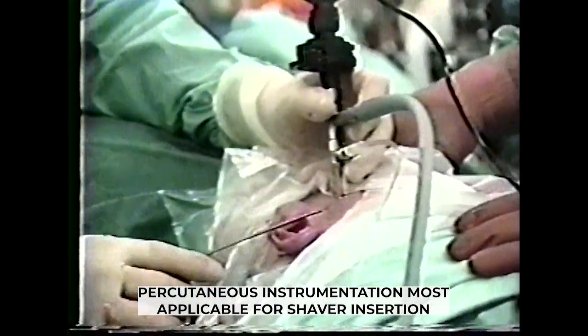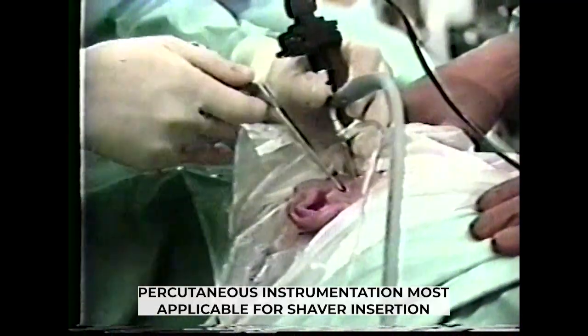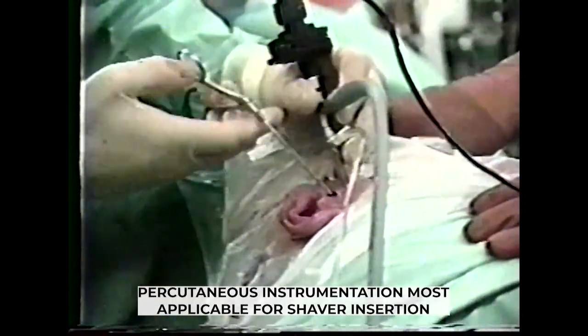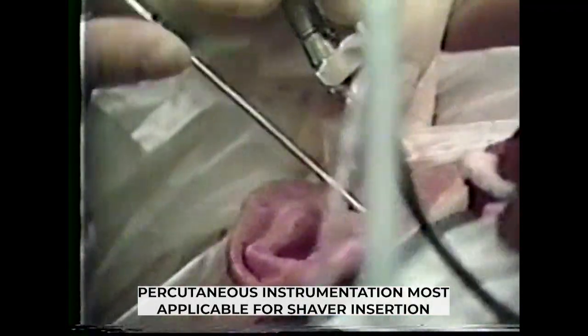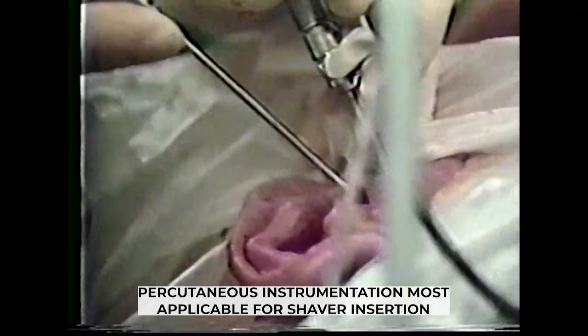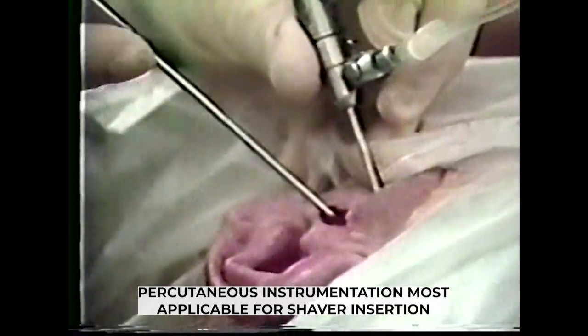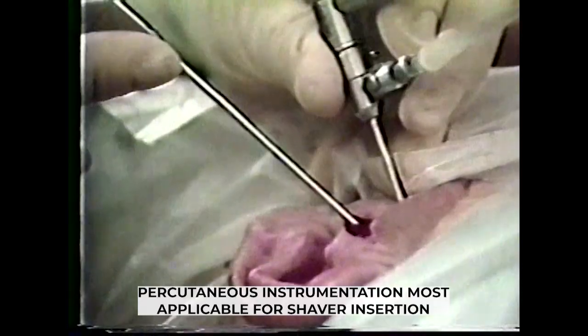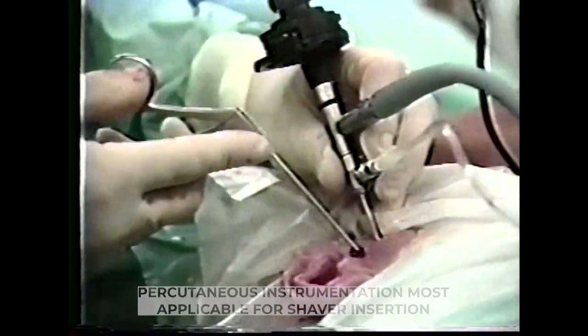This approach is restricted to the infralateral and anterolateral portals. The cartilaginous posterior wall of the joint is too rigid to permit direct insertion of instruments endaurally without the use of a protective cannula. Care must always be taken not to denude the meatal cartilage, which may subsequently result in otitis externa.